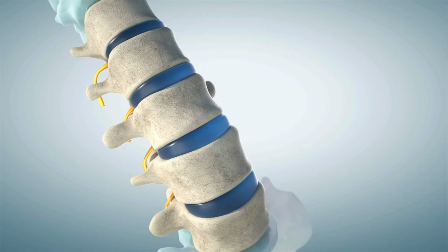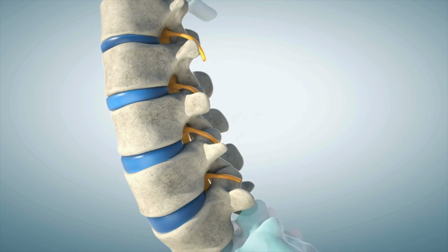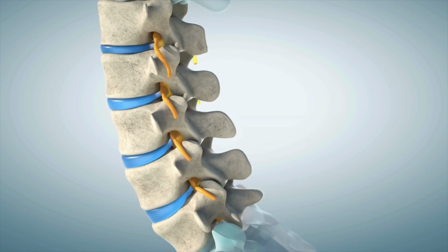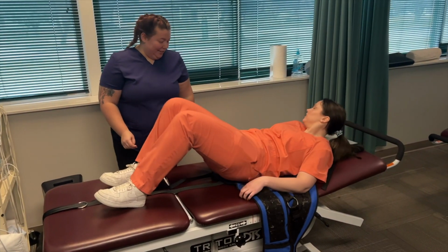If we think about compressive forces on a water balloon, when we compress it top to bottom, it's going to squeeze everything to the outsides. But if we pinch that water balloon top to bottom and pull apart, it creates an internal vacuum on the disc, drawing that material back to the center of the disc, therefore pulling the pressure off the nerve root and allowing for relief from pain. If you can do that long enough, frequently enough, and keep the swelling down, you start to get a scarring type approach to the outside of that disc where it was damaged, and it creates a barrier there that helps keep that from being a problem in the future.